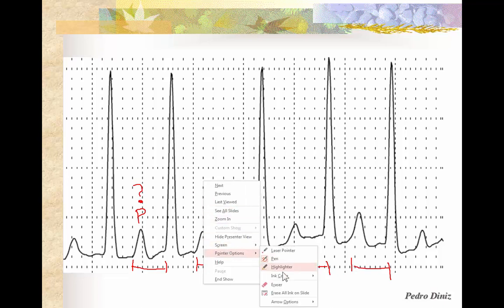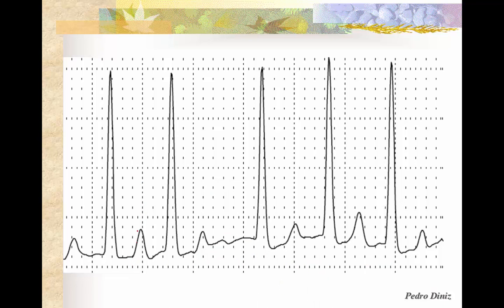On the other hand, if these are T waves, then the QT interval will be this distance right here. The next one will be somewhere here, and the next one somewhere here. As you can see in this example, the QT interval is much more constant than if these were P waves.